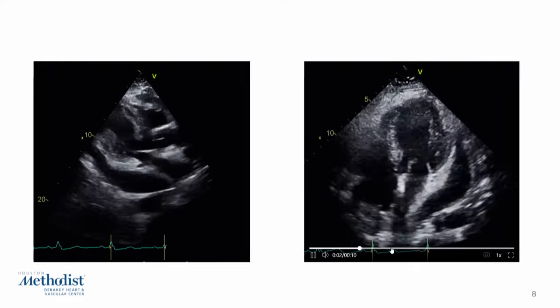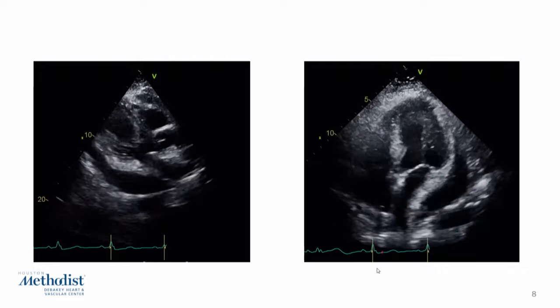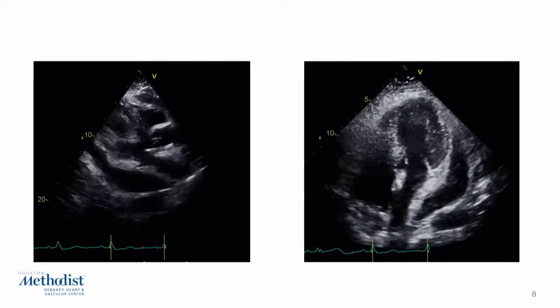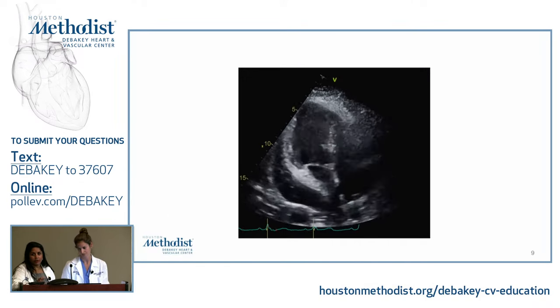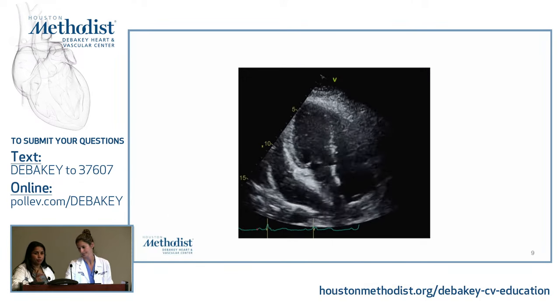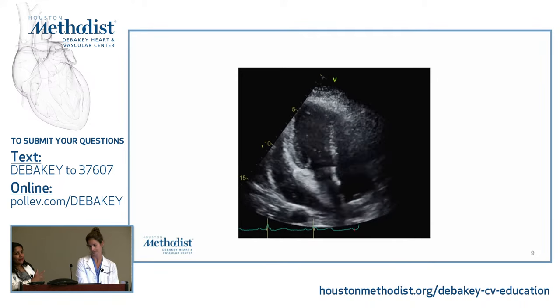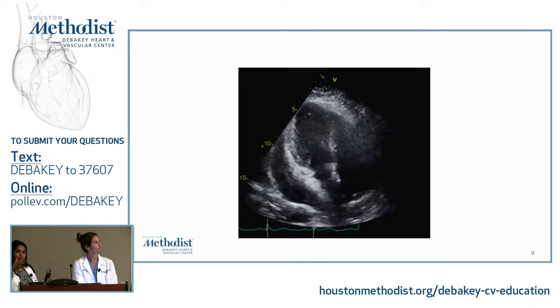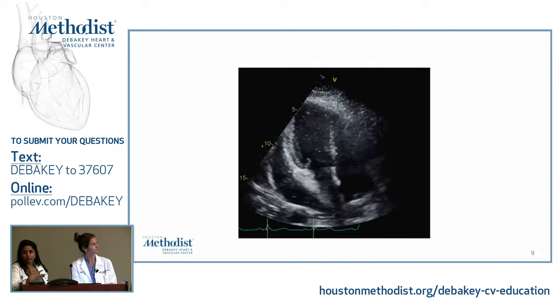So what's different about this case, guys? What do you think about this one, right? So post-operative, very, very common scenario. I think every cardiology fellow is going to encounter this at least once, post-operative pericardial effusions, especially post-CABG, post any sternotomy we are talking about. So important to analyze that these patients typically don't have that classic circumferential distribution. They can be localized, right?